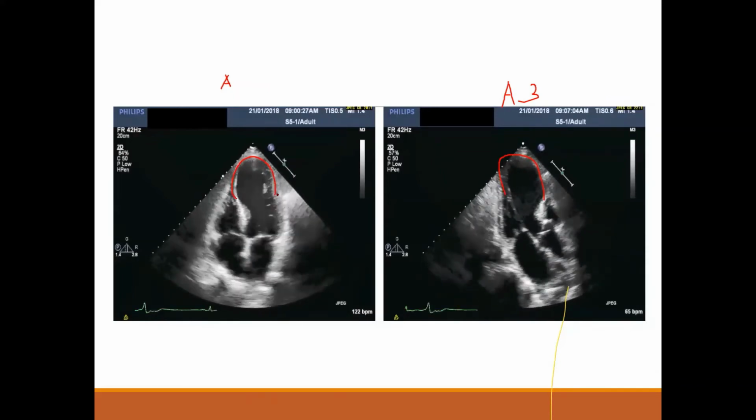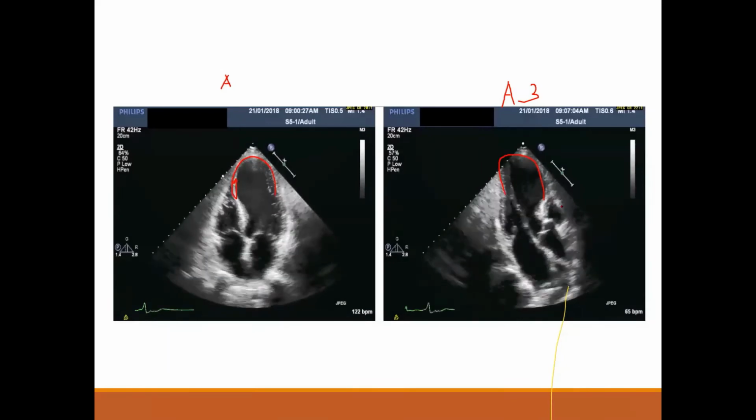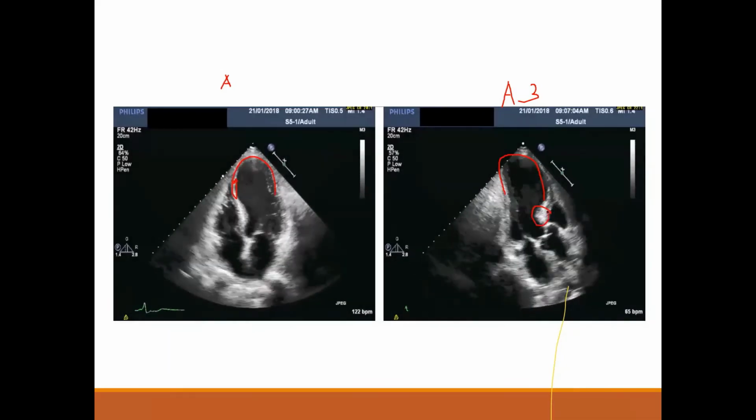Now, with mid-lateral aneurysmal apex. Here, this is the inferior septum. And also here from the mid down, it's akinetic, along with the apex. And here the anterior septum is pairing only this small part. Now we have akinetic anterior septum. So we have a wide range of regional wall motion abnormalities. Okay. Good.